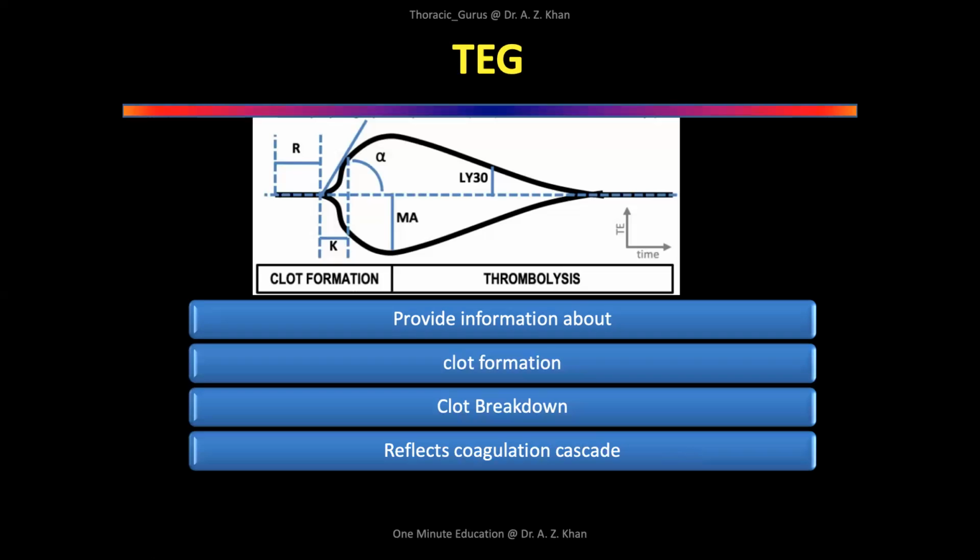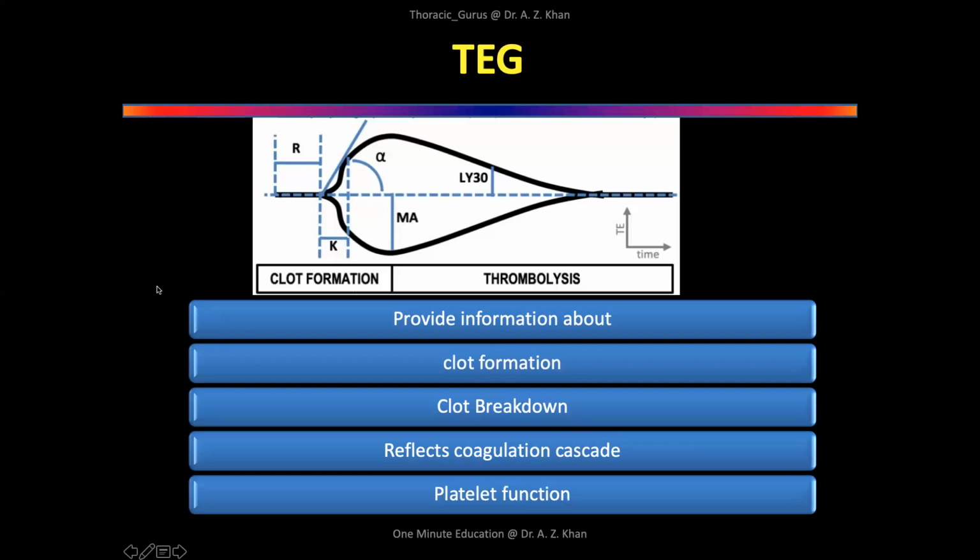One more point. Platelets. It can give you platelet function, okay? Because on the basis of the TEG, you can actually decide whether to give platelets or not to give platelets. So it looks at all of these, all right?